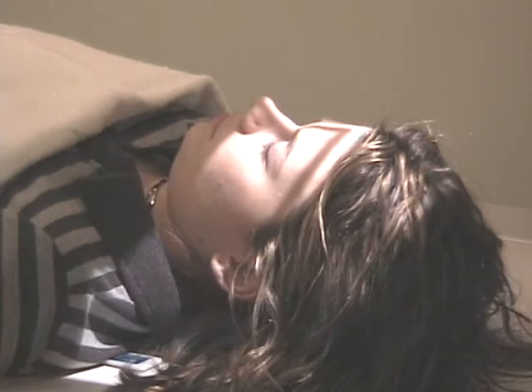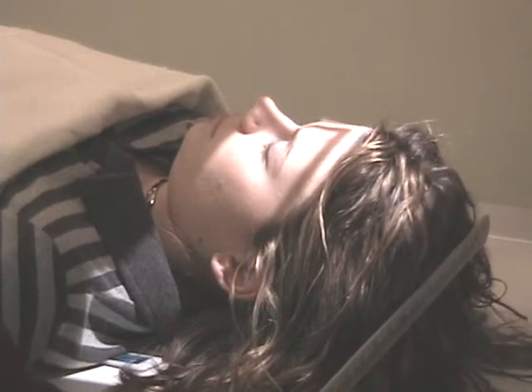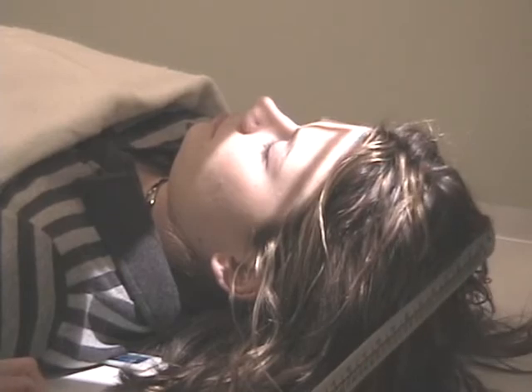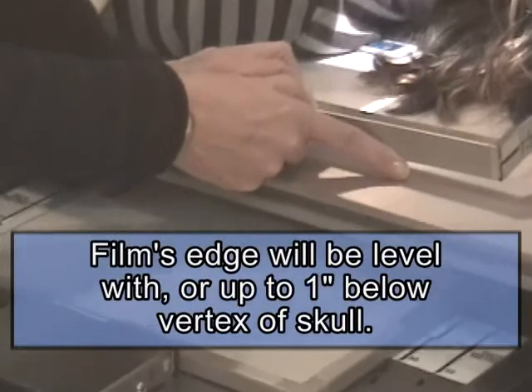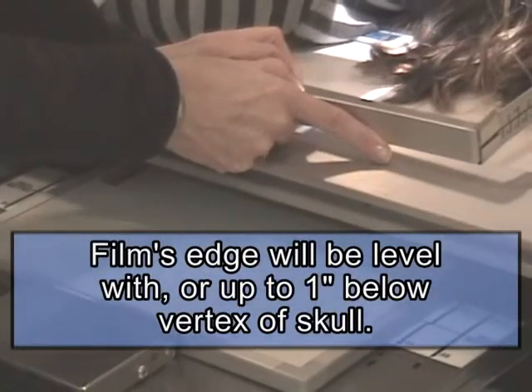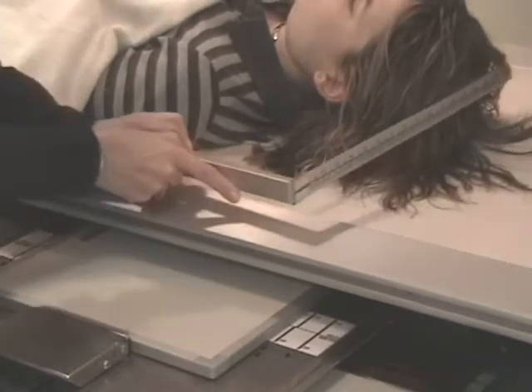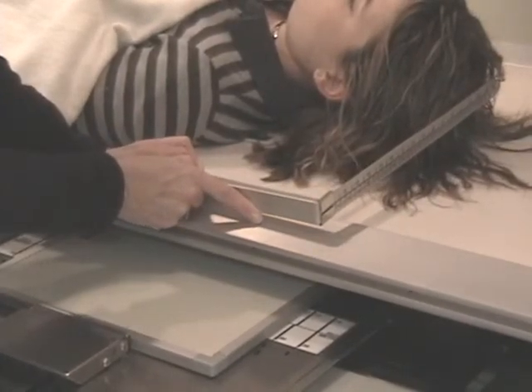The film's edge will be level with or up to 1 inch below the vertex of the skull. And in this case, we have the film's edge about 1 inch below the vertex of the skull. When you're using calipers or some kind of straight edge, make sure you come off at a straight angle when you evaluate your film's edge.